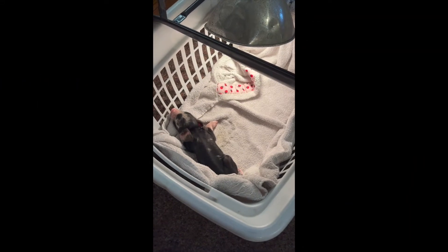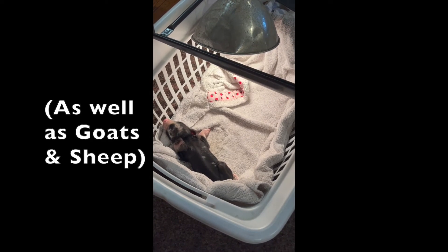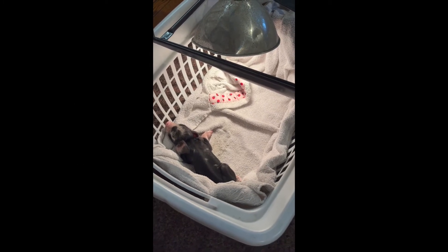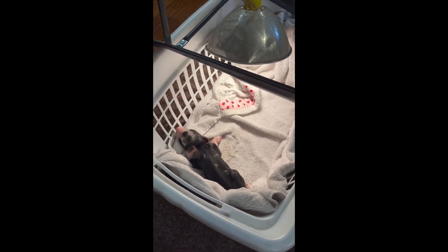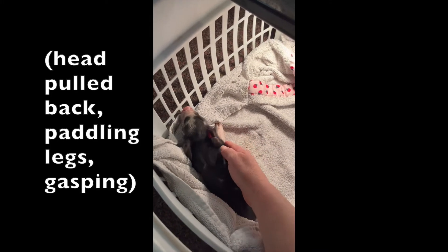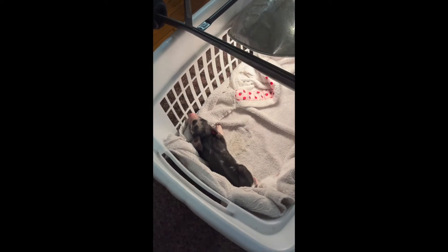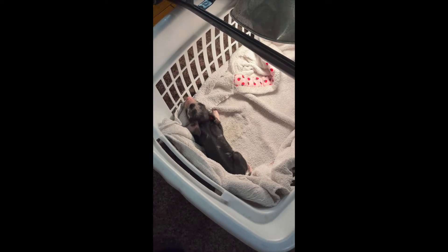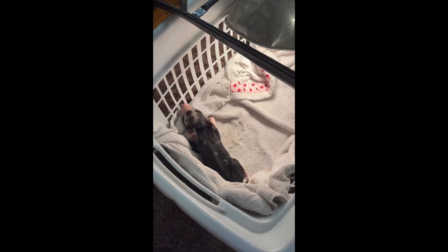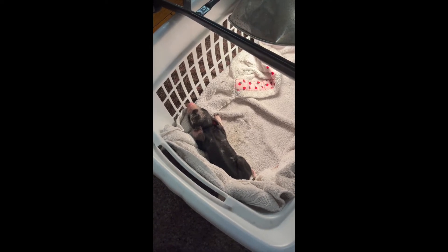Welcome back to Fixing Critters on the Farm. Sometimes when you raise pigs you're going to end up with a runt or a sickly pig, and you might want to step in and try to keep that piggy alive. I'm going to talk today about how to tube feed. This little piggy has been in the house all night — it came in very shaky with neurological symptoms, on its side, kind of spinning around, eyes weren't focused. I started out by giving it some warm water with honey and baking soda mixed in to get its sugars back up and normalize its acidity.